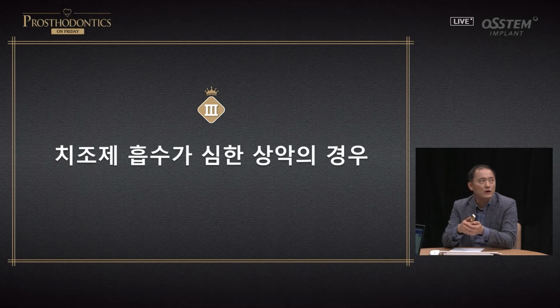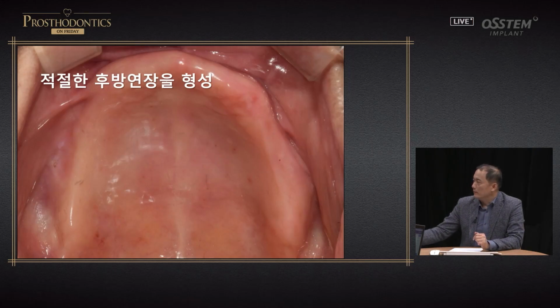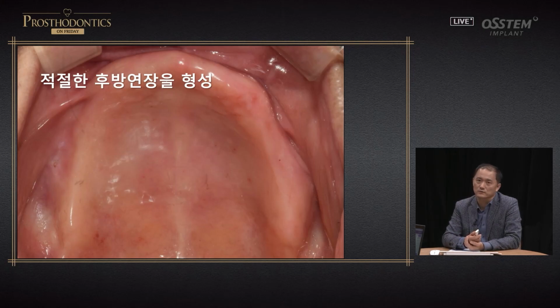Next is the case on the maxillary side, where there is a lot of alveolar ridge resorption, as you can see here on the distal side. On the maxillary tuberosity, you cannot really see the ridge. It's too flat, like the ridge is on the level of the vestibule. And in such a case, it's really tricky to gain retention. Even if the tissues are good, if there is a slight malfunction, the denture can become detached.